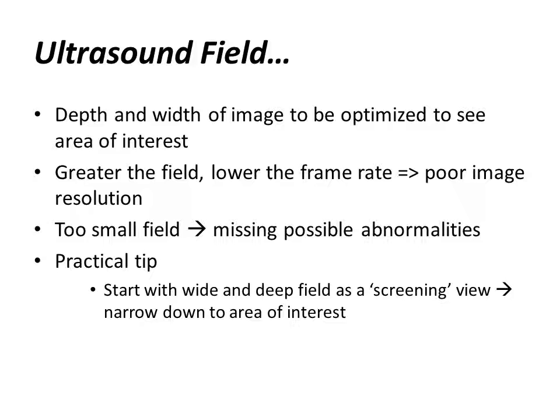On the other hand, if that is out of your control, if you have an obese patient or you need to see a very posterior structure, then you need enough depth, which means you will have to use a longer wavelength, or an ultrasound wave of low frequency, in which case you may get the depth you need, but you may not get the resolution that you want. So it's a bit of a trade-off, like most things in life.